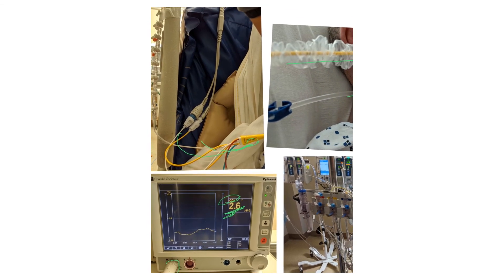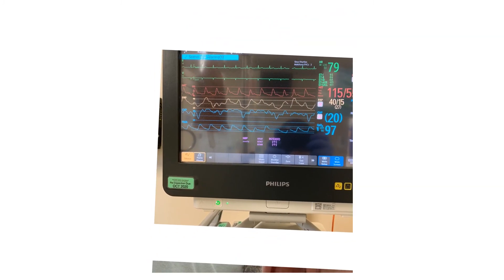Now I want to show you the monitor. This is a real patient. This is the CVP, continuously monitored — that's 20 — and this is the right atrial waveform. This is the arterial line as we explained, and this is the pulmonary artery pressure being continuously monitored. This is the waveform we talked about, or will talk about, depending on the order of these videos.